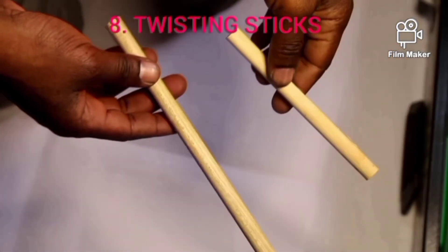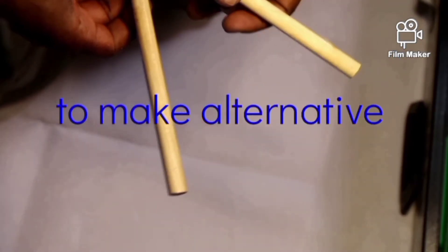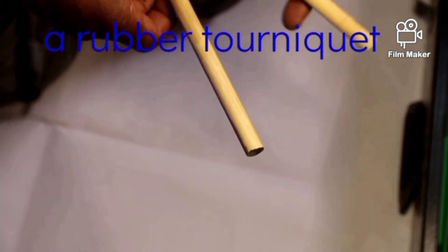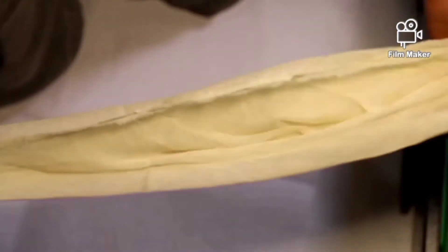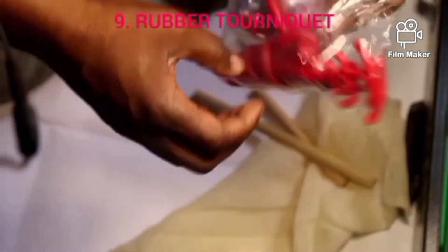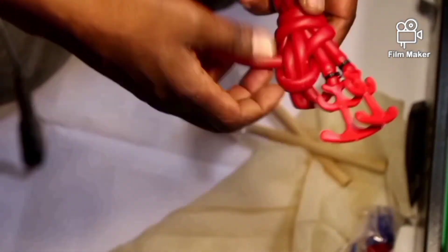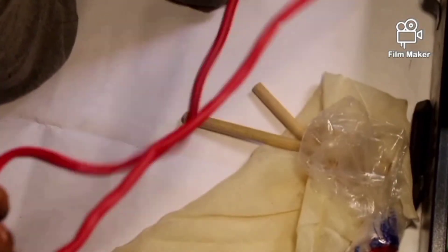Item number eight is twisting sticks. These are used mostly to make alternative bandage tourniquets in place of rubber tourniquets when we do not have enough of them. They are used together with the triangular bandages to make tourniquets. The rubber tourniquets — we have two of them. This is how they look like. This part here is used to fasten them.